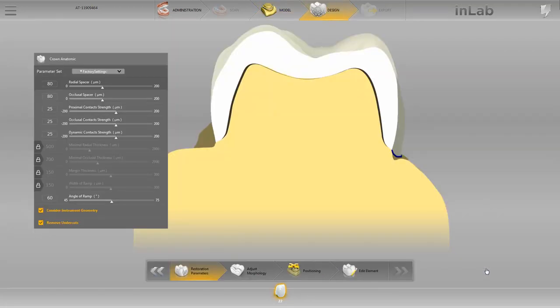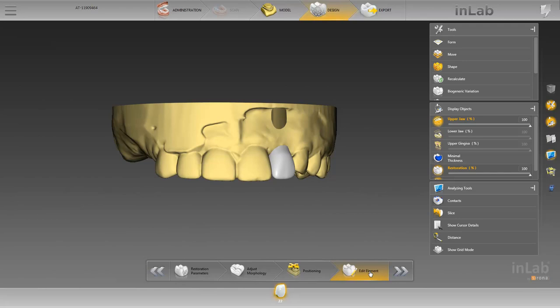In our case we keep the factory settings parameter settings and initiate the calculation of the design proposal by clicking the edit element step. The design can be modified by activating different functions in the side panel. Once you are satisfied with the design, you can move to the export phase, in the case of a cemented crown, and start the manufacturing process.